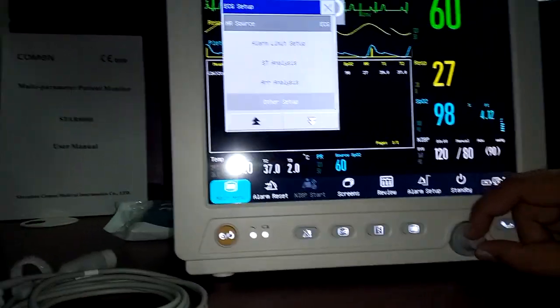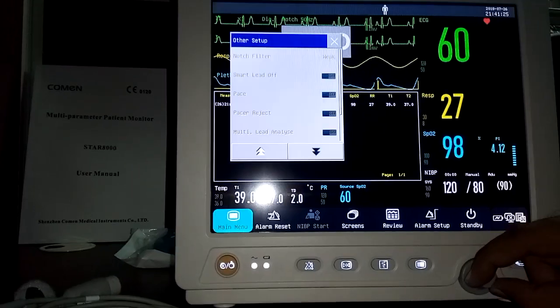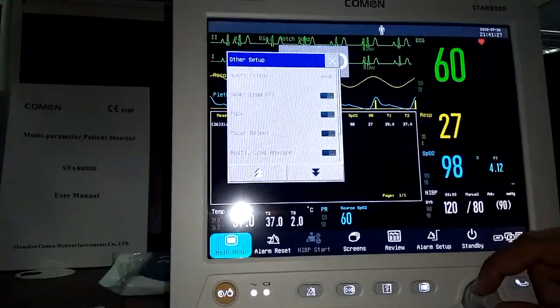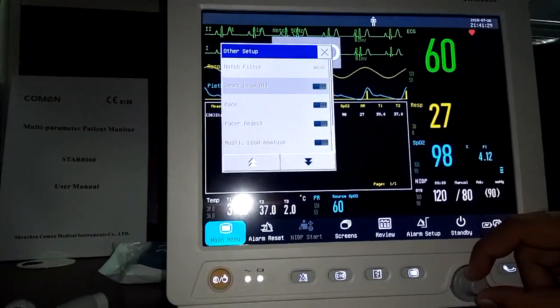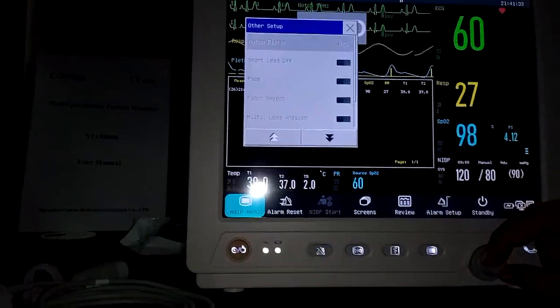Additional ECG settings include pacemaker on/off, filter type, and arrhythmia analysis options. Note that this monitor is currently in demo mode, so some parameters cannot be changed right now.